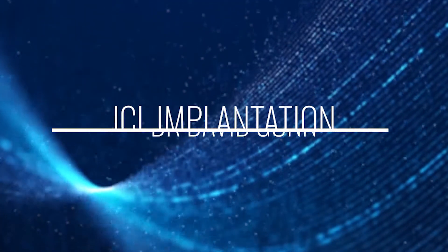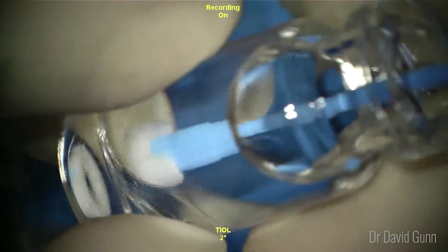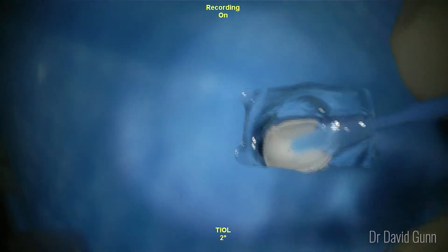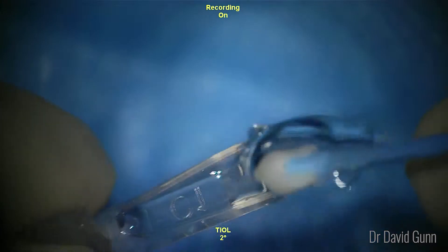This is David Gunn from the Queensland Eye Institute, and this video presents my technique for implantable collamer lens insertion. The process starts with opening the vial that contains the ICL and removing it gently with the soft-tipped sponge injector. You can see the correct vaulting of the ICL there.